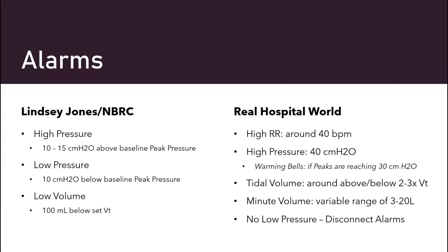So if you're like, okay, my peak pressures have been in the low 20s, like 22, but now all of a sudden I'm at 28, what's going on? That's kind of when I want warning bells to start going off.